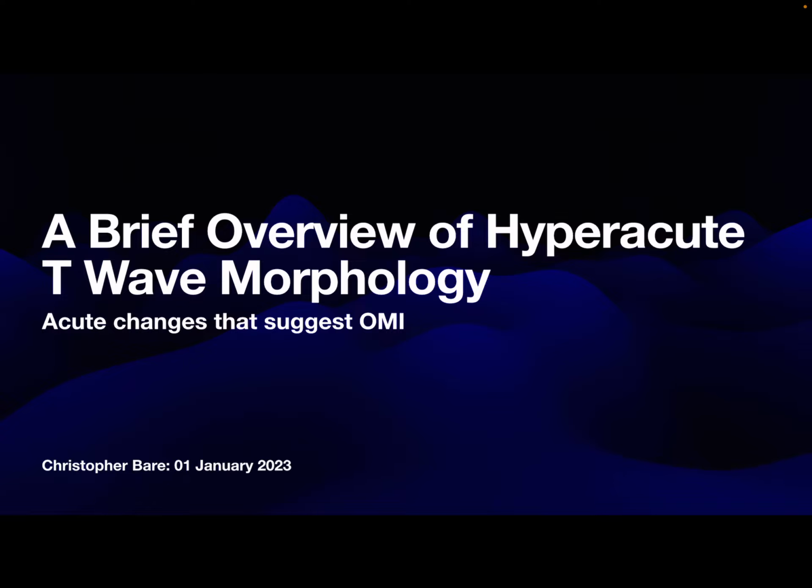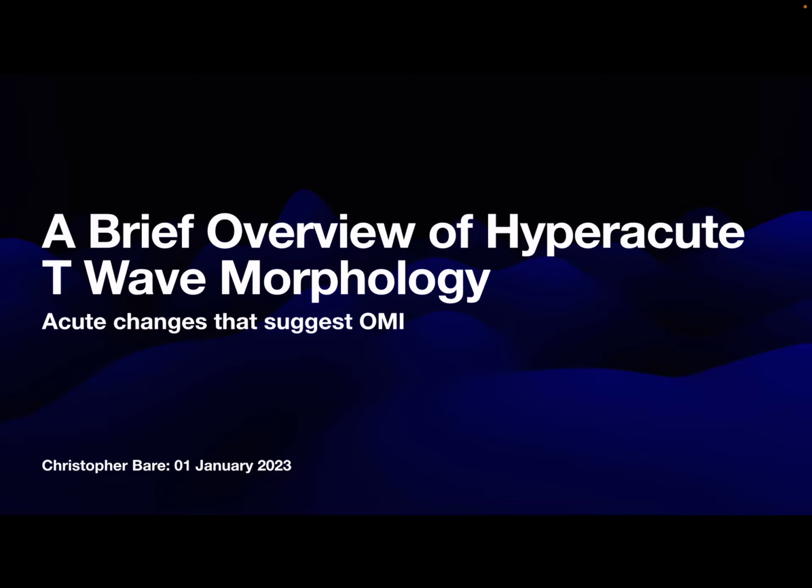We're going to go ahead and talk about the next finding, or the next paradigm, that is considered a STEMI equivalent as outlined in the 2022 ACC consensus statement. And this particular finding is something referred to as hyperacute T-wave morphology or hyperacute T-waves. And this is actually a really important component to identifying an OMI, an occlusion myocardial infarction, as opposed to STEMI.